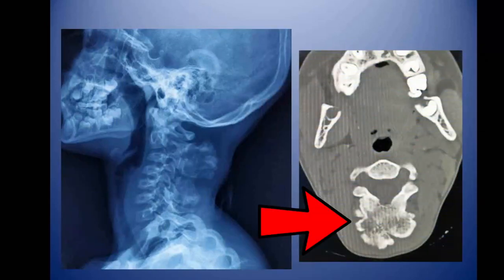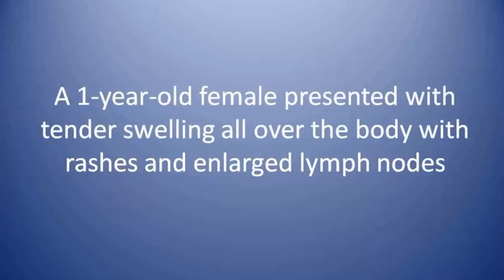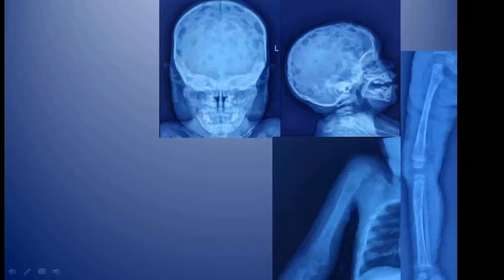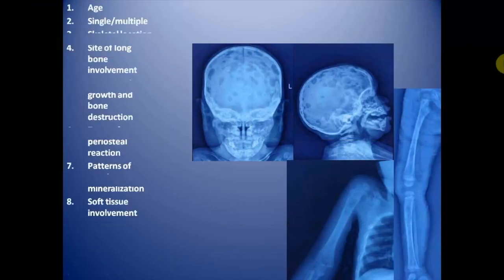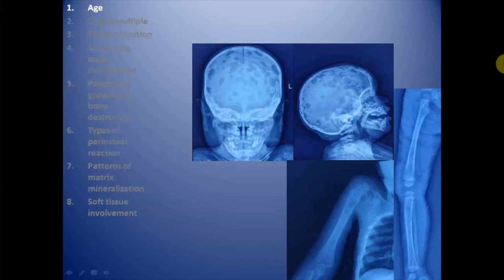This is the case of a one-year-old female who presented with tender swelling all over the body with rashes and enlarged lymph nodes. These are multiple radiographs of the patient covering the skull and long bones of upper and lower limbs. We are going to evaluate this lesion on the basis of multiple criteria.